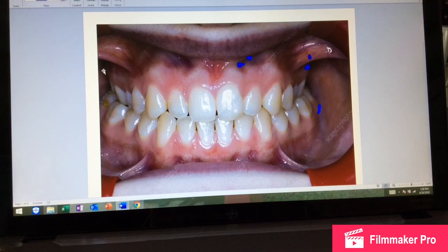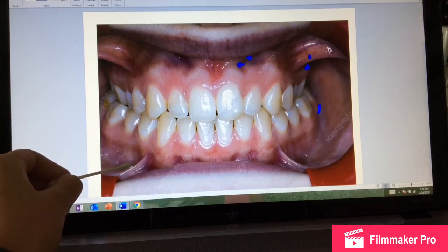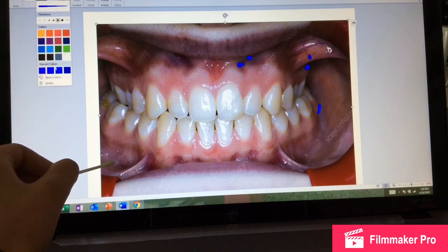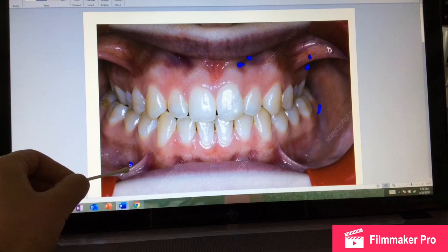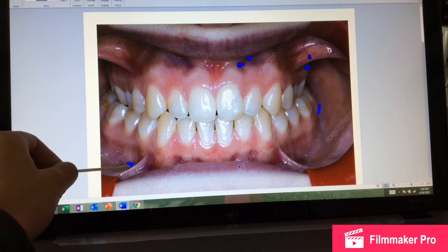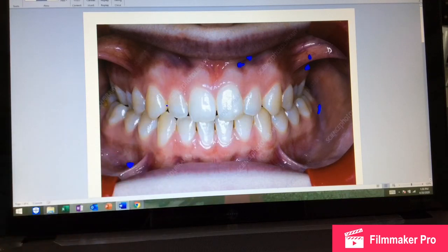We're going to do that using our mental nerve block, which, how I learned in the past, is in this area right here, and you need to put pressure in order to numb those teeth. So topical will go here, and then the injection pressure in order to numb this area as well. That's for our incisive block, on the buccal side of the teeth.